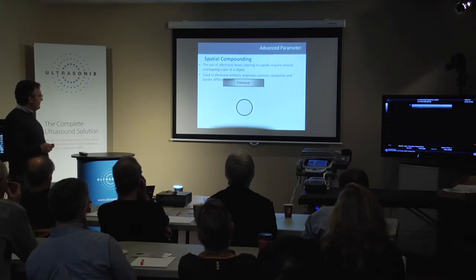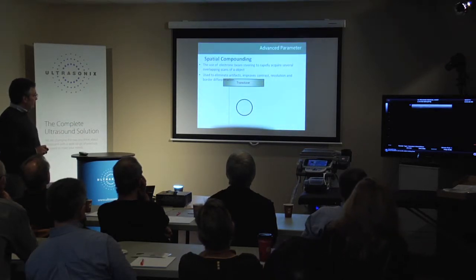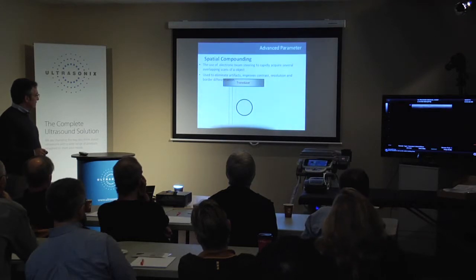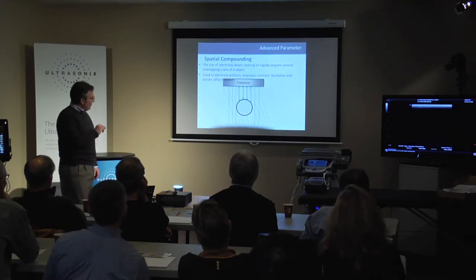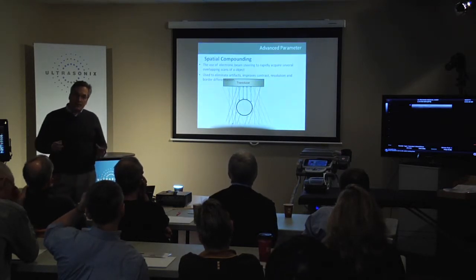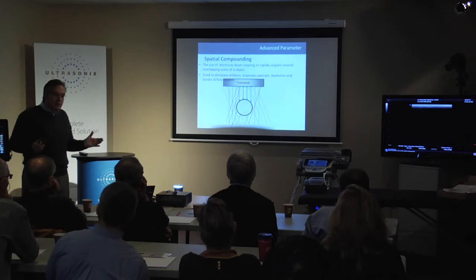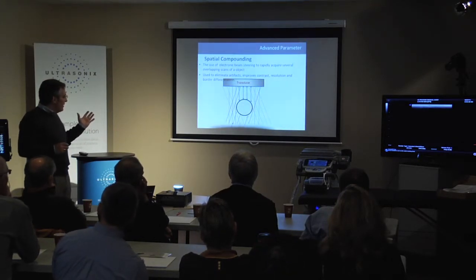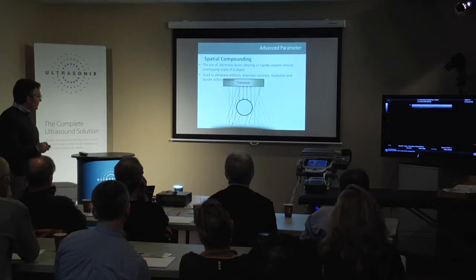Spatial compounding is one of the advanced features. You know conventionally, in the previous slides that we've shown you, that when we send a pulse from the transducer hitting a structure, we listen for return echoes. With compounding, we actually steer trapezoidal scans tangent to the information that we normally use fundamentally, and we collect all these return echoes. The resulting image is that we have a better ability to filter out haze and noise, which are two parameters that contribute to image degradation, creating image artifacts. As a result of all these multiple scans from these multiple angles, we have a better idea to filter out, resulting in better contrast resolution and image enhancement for border definition.